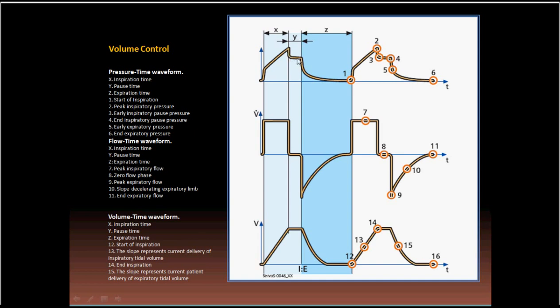If you put an inspiratory pause, this is the time. So this is the peak pressure, and this is a drop of the pressure when you put an inspiratory pause. This means that after delivery, you stop inflating the patient by stopping inflation through the inspiratory limb. No more flow. So the pressure resulting from the flow through the bronchial tree, which is the pressure resistance, will be 0.